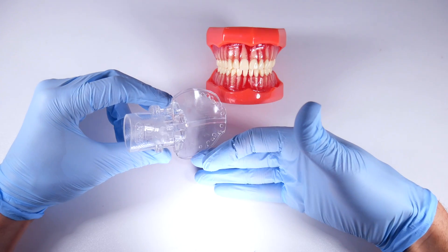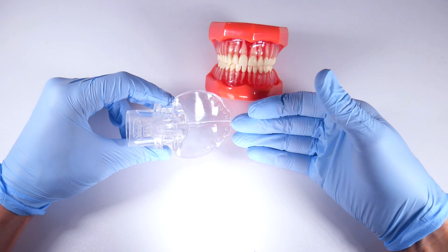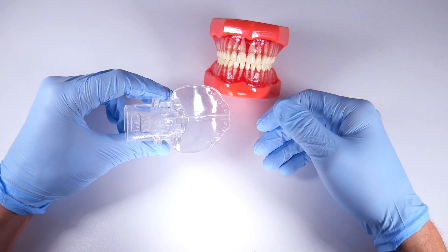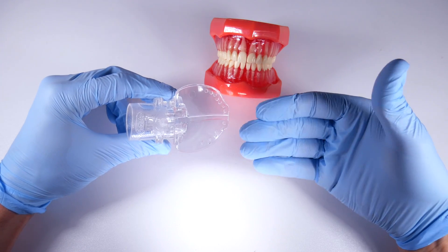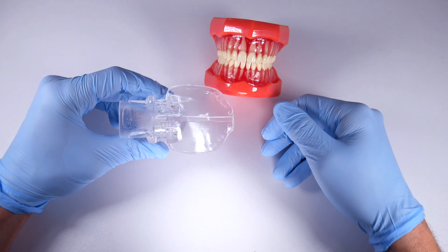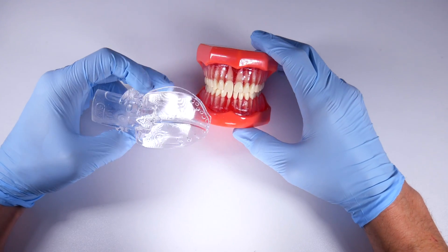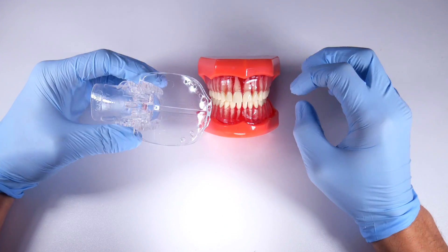This helps retract the tongue and doubles as an oropharyngeal screen so you're not going to lose anything down the patient's throat or into the airway. It's also suctioning, so when you're using your handpiece your assistant is suctioning too, but this picks up anything they might miss or any overflow — which is really good for bleeding as well, so the patient isn't swallowing as much blood while you're working.